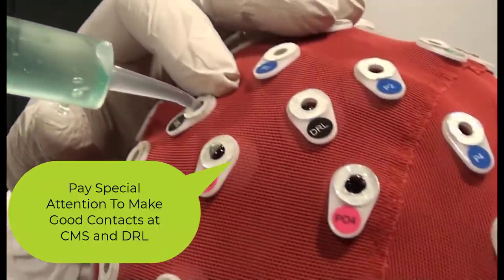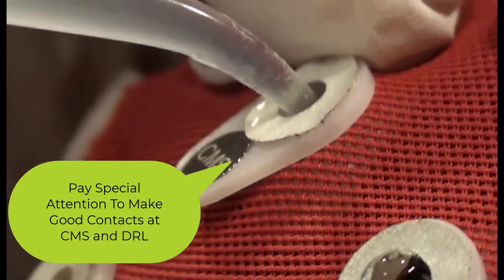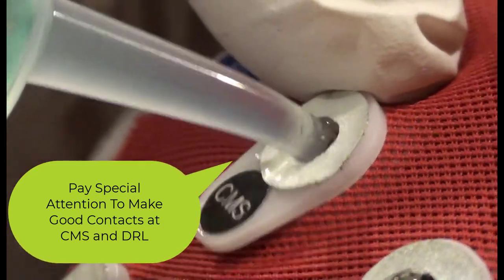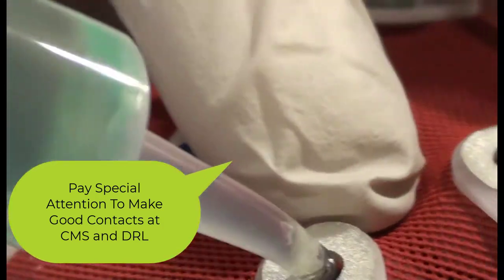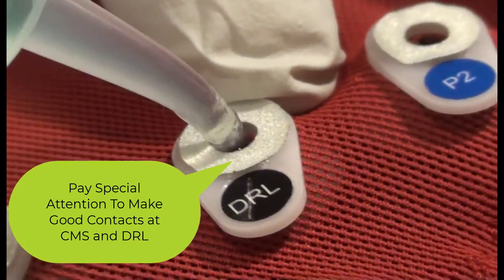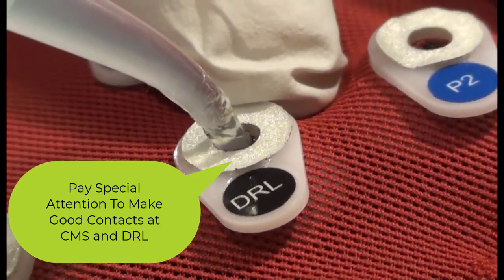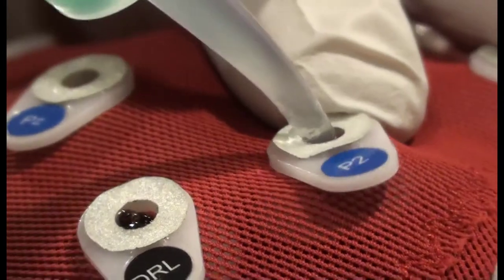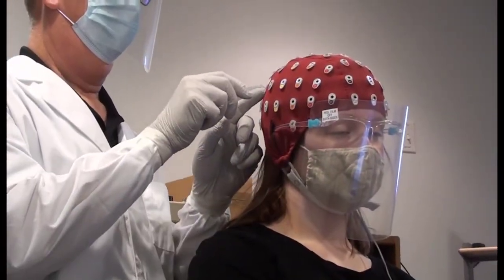Try injecting gel without using the tip of the syringe to part the hair. If the participant reports that they feel the gel, you can save time by just injecting gel in a similar way at each site. If they don't feel it on the first try, this is an indication that it would be advisable to use the tip of the syringe to part the hair before injecting gel at each site.